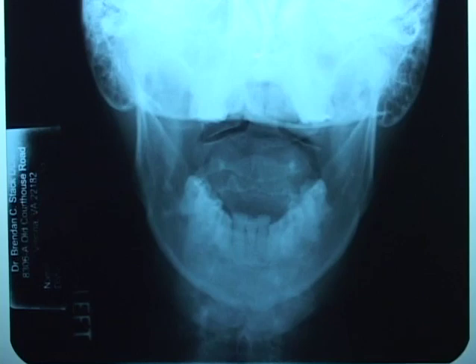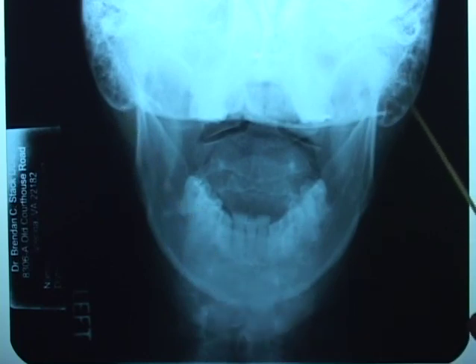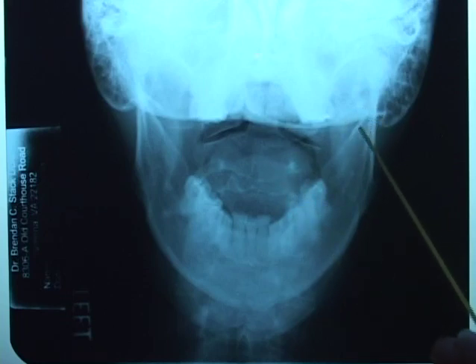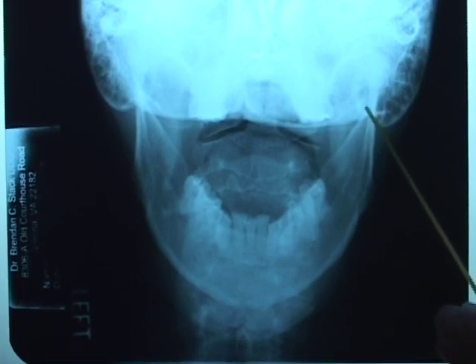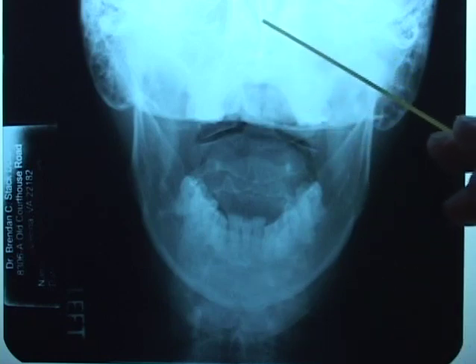This is this patient's frontal X-ray. You can notice that the mastoid processes of her temporal bone are not equally aligned. This one on the right side is caved in and closer to the midline than is the left. These temporal bones contain the glenoid fossas, so you can see that the glenoid fossas are not lined up symmetrically either. This is the probable reason why the disc on the right is picked up as being displaced by the MRI. You can also see that she has a deviated nasal septum right up here.